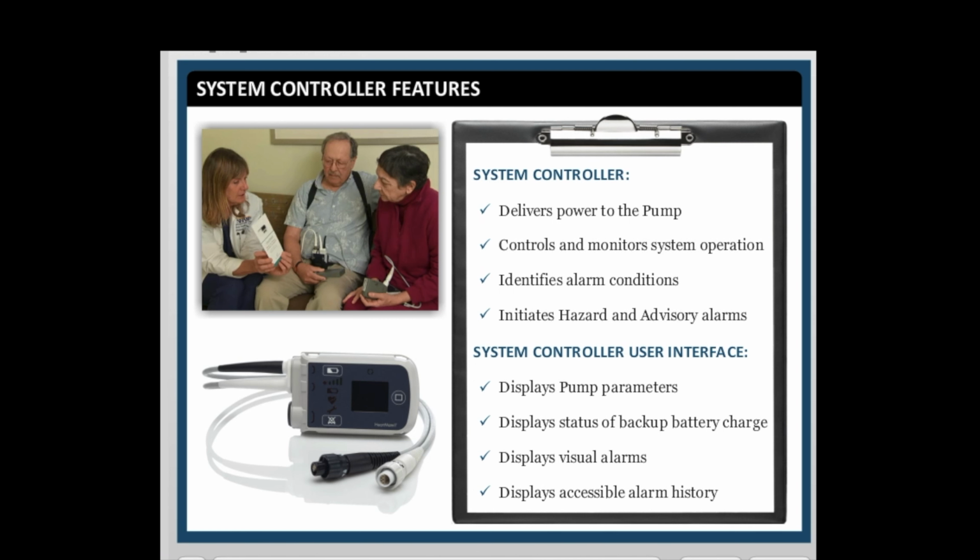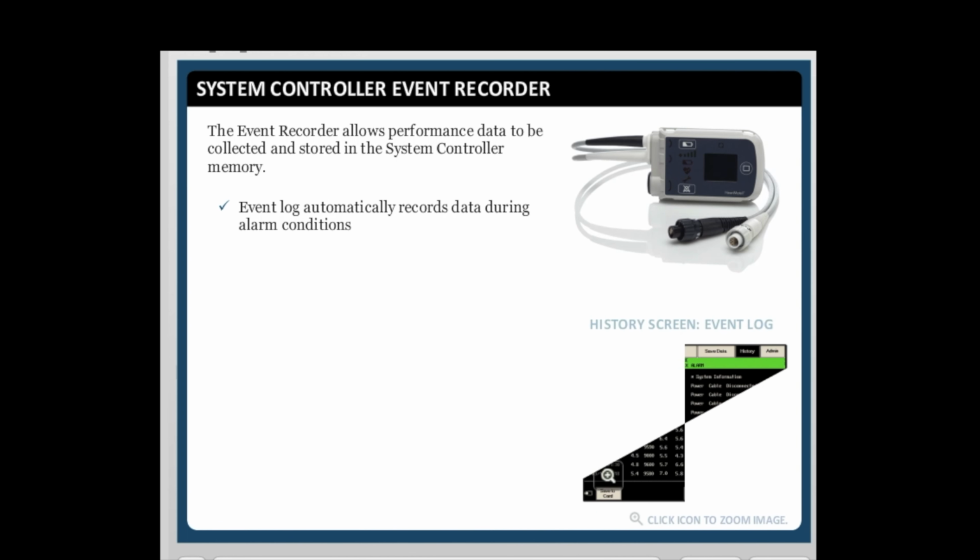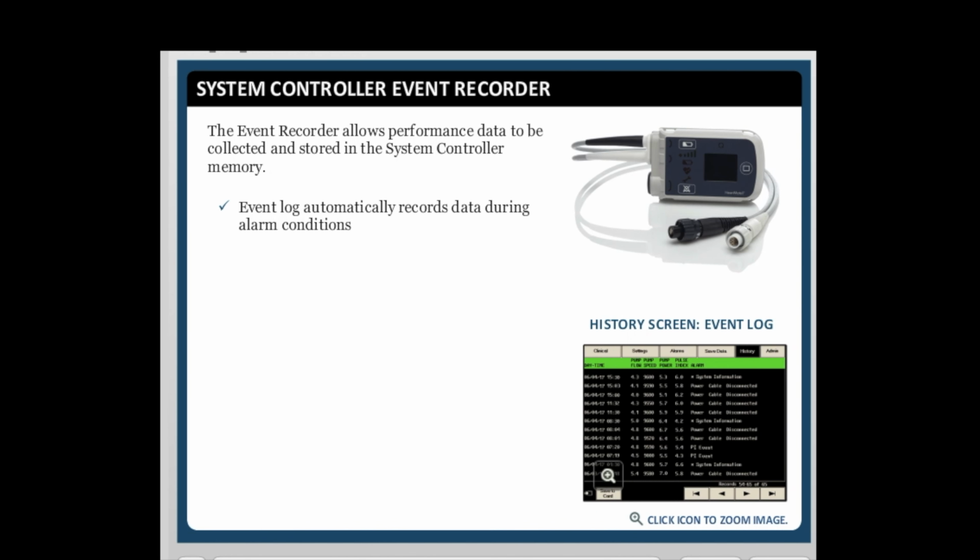Additionally, the system controller houses a backup battery, provides driveline diagnostic capability, and records and stores alarm data and device performance data. The event recorder is a feature built into the system controller that allows performance data to be collected and stored in the system controller memory. It is always on and cannot be turned off. Data is stored automatically in the event log when an alarm or PI event occurs.